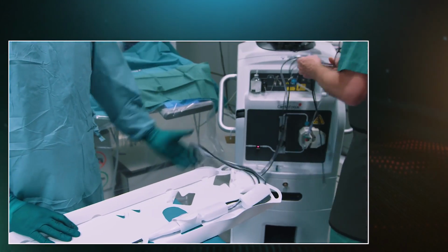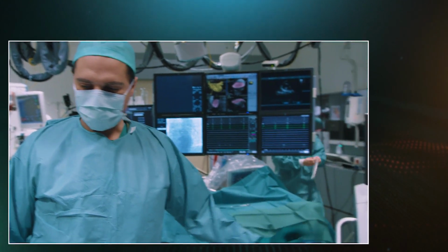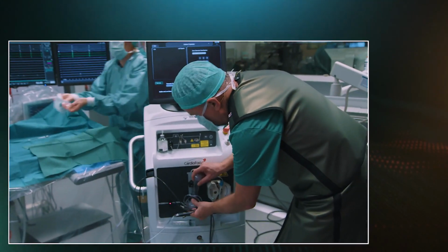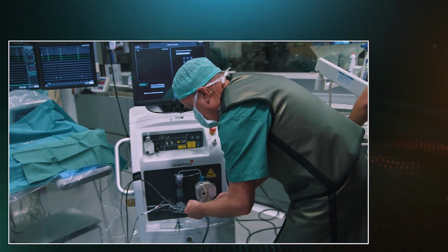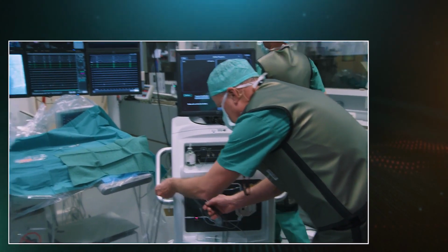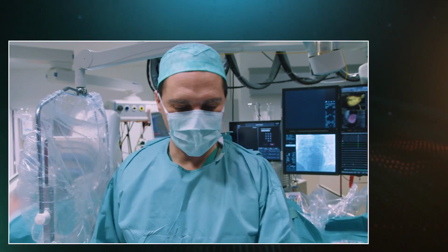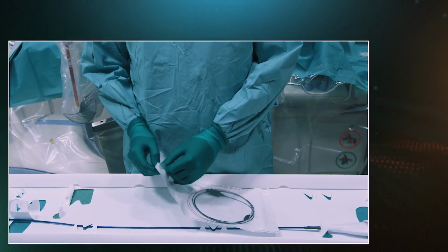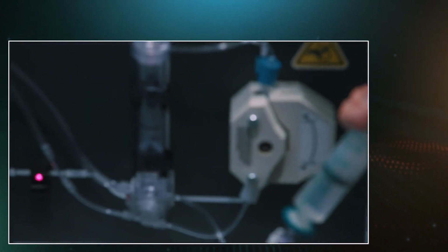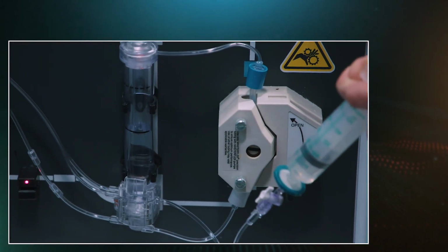While our technical support, Eric, is doing the preparation and is going to prime the system, I can start flushing, I can start infusing the D2O, and I really don't need an extra pair of hands. I really don't need extra help, which is, of course, convenient. I'm going to prepare this already. You can see Eric priming the system. And Eric, as before, I would like you to hit run pump already.